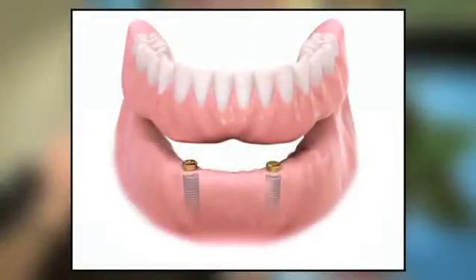Overdentures are very, very important. What an overdenture basically is, it's a denture that actually attaches to something in the mouth, so the denture will stay down. It doesn't come up, okay? It will be fixed into place. And originally these were supported by remnants of teeth. There'd be teeth left, and we put attachments into the teeth and then make the overdenture to stay in.